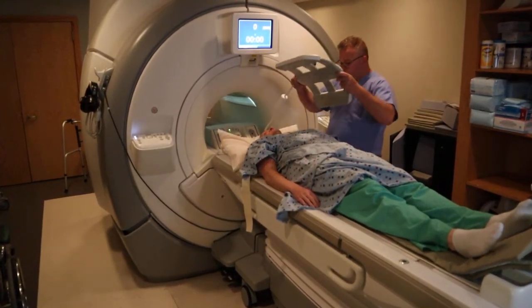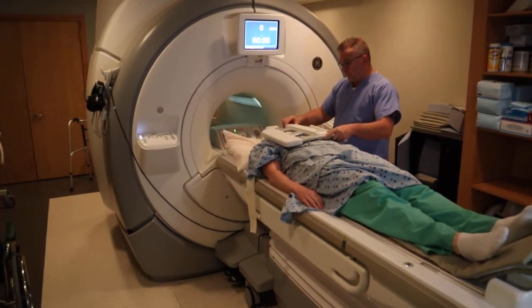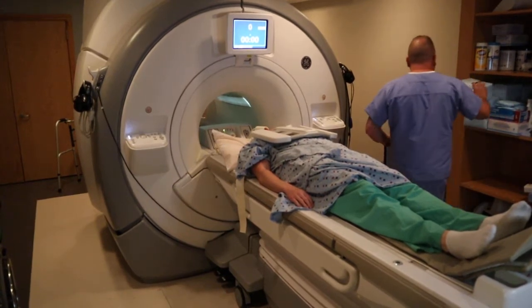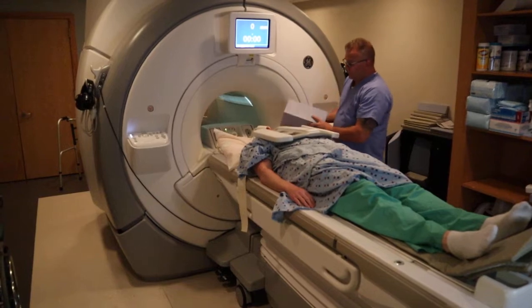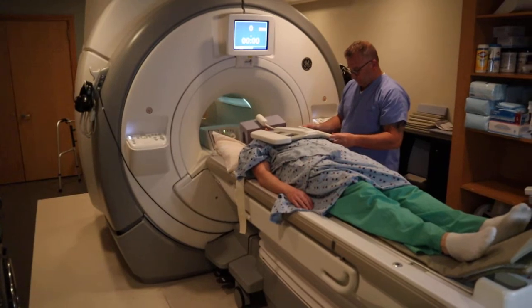You're going to attach the anterior piece, and you want to ensure that the anterior and posterior pieces are matching to provide optimal signal. You also want to ensure that the cables are not touching the patient, as that can cause burns.